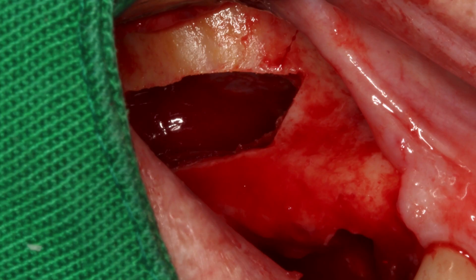And of course, after working with the curette on the floor of the sinus and separating the membrane, this is the end result that we're looking for: complete separation, detachment, and passive lifting of the sinus away from the floor, away from the lateral wall, superiorly, and into the medial surface of the sinus cavity.